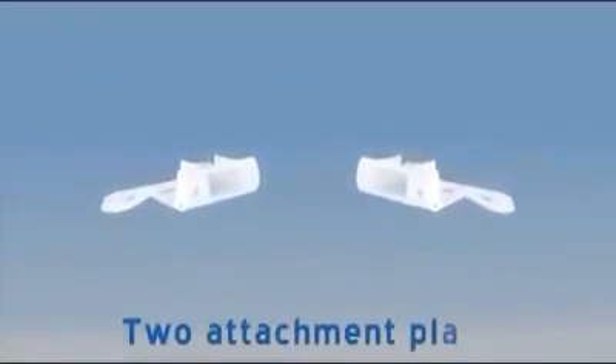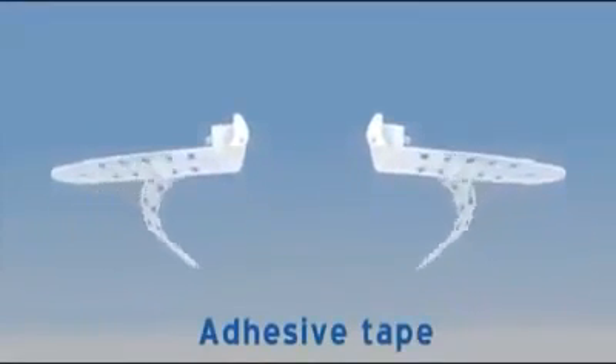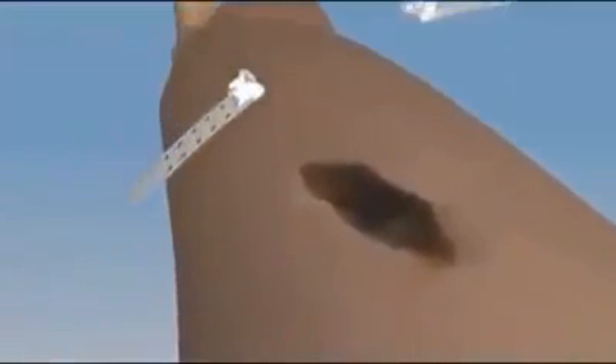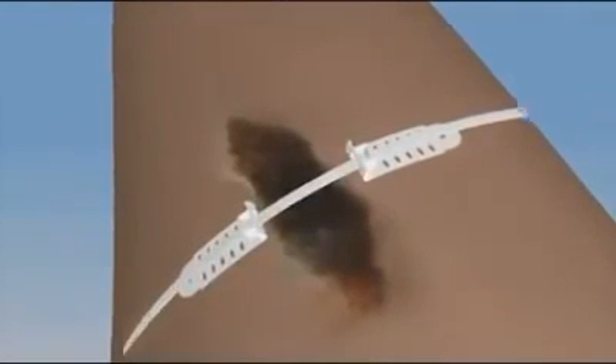The TopClosure 3S system can be applied in a non-invasive application for skin stretching by tape adherence to the skin. The system is used prior to a surgical procedure by stretching the skin where direct skin closure is anticipated to take place under excessive tension.